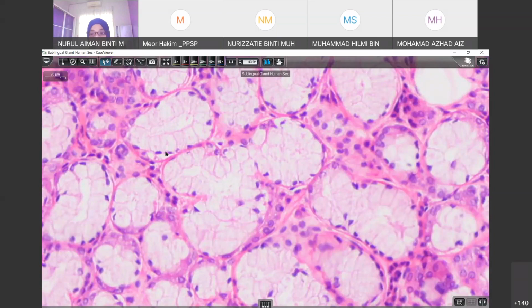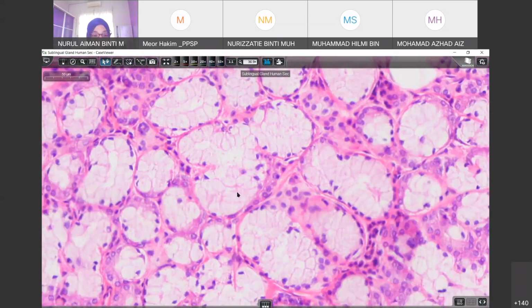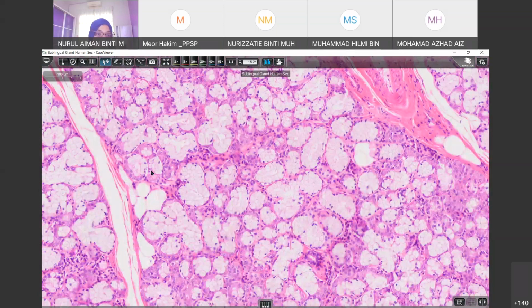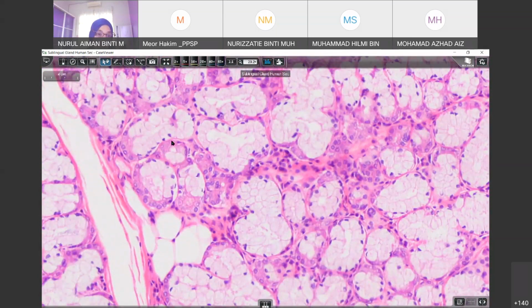Okay, secretory portion. Here is actually another group of serous demilune cells, but I want to show you with a clearer appearance, where you can see the difference between the mucus gland here and the serous gland. It is just attached to the tubular gland. So this is actually the acina gland. Because of the combination, it is known as the tubuloacina.